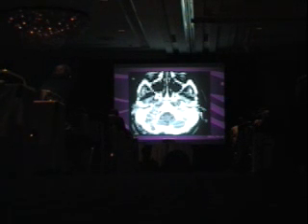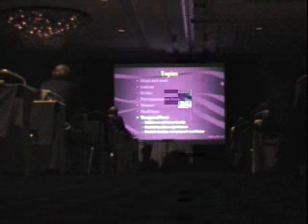Basically, what else is in the differential? Not much for this. If you really want to get to PhD level, there's something called endolymphatic sac tumors that live in the vestibular aqueduct that could look just like this. And that's probably everything that's in the differential diagnosis for this.